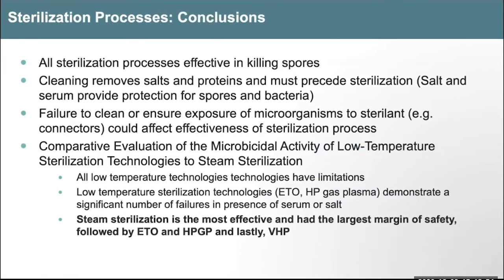All sterilization processes are effective in killing spores. Cleaning is critical to remove proteins and salts. Failure to clean or ensure exposure to sterilant could affect the effectiveness of the sterilization process. So for instance, if you have a long, narrow lumened tube and you don't connect it to the sterilization process, passive flow is not adequate. You need active flow for a low temperature method. All the low temperature technologies have some limitations. Some of them that are used, ETO, HP gas, plasma, in the presence of salt and serum, can fail. So cleaning is critical. And of course, steam sterilization is the best method.